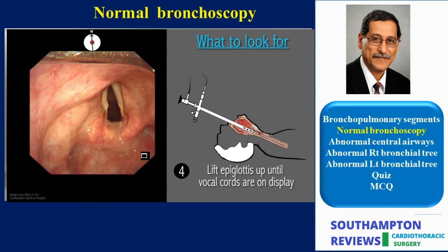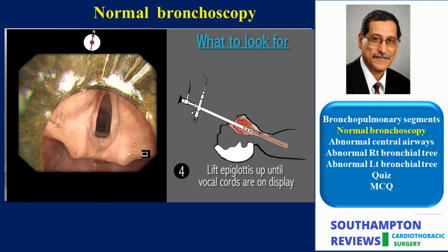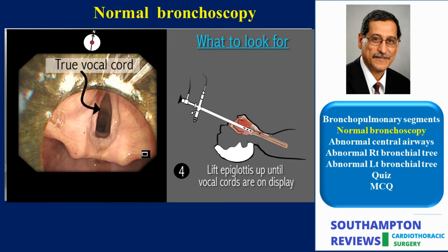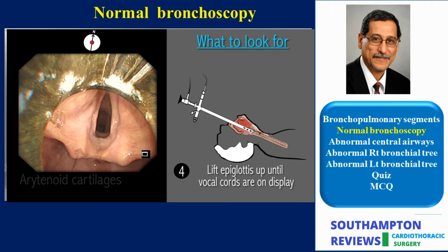Once the epiglottis is lifted and the scope is advanced for a couple of millimetres, the vocal cords should come into view. The operator should make note of any abnormalities of the epiglottis, vocal cords and the larynx. These should be reported to the ear, nose and throat surgeons for advice or follow-up, preferably with a photo of the abnormality.